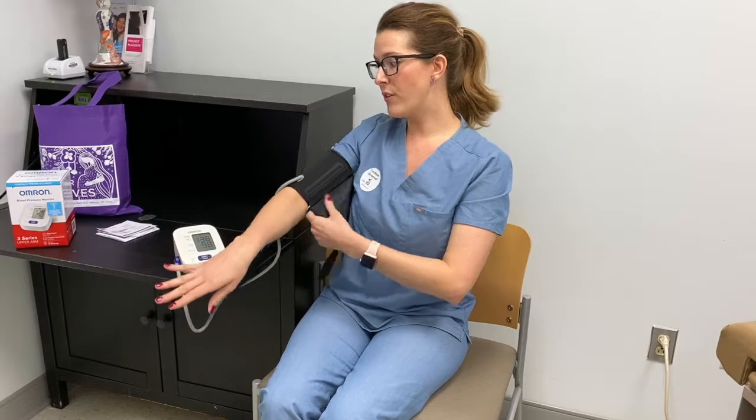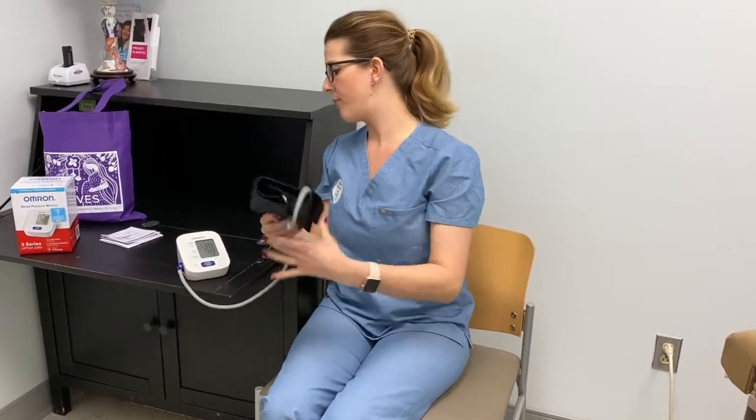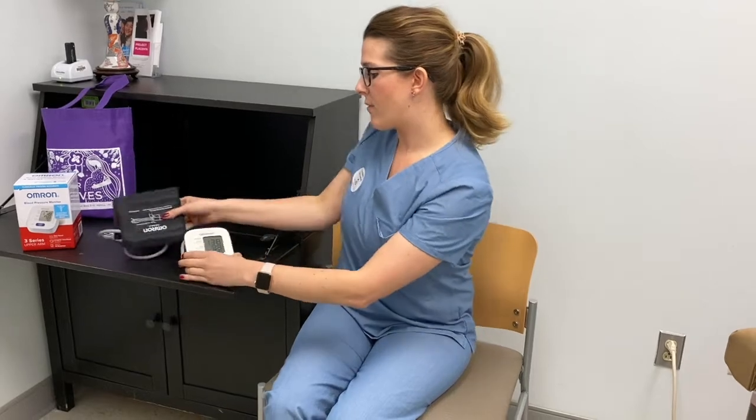This will save your results, but I would recommend writing down the day, the time, and your result just on a piece of paper that you can keep with the cuff. All right, so that is how your blood pressure works.